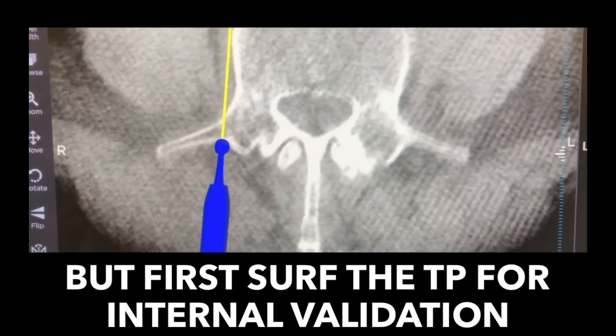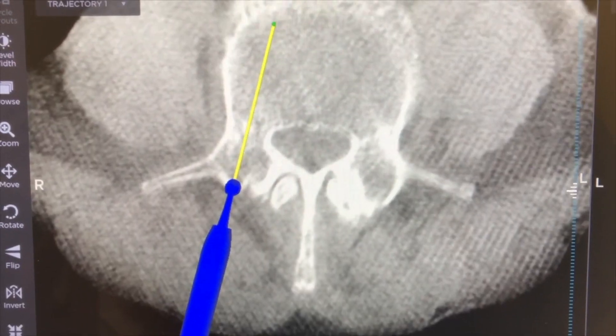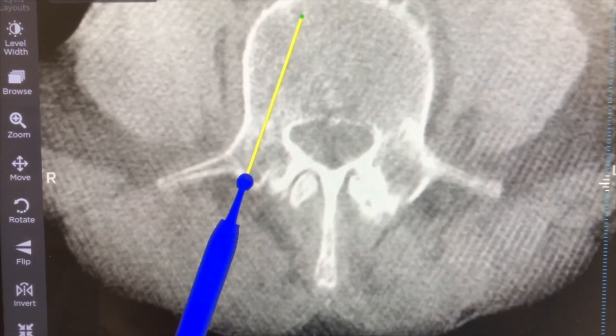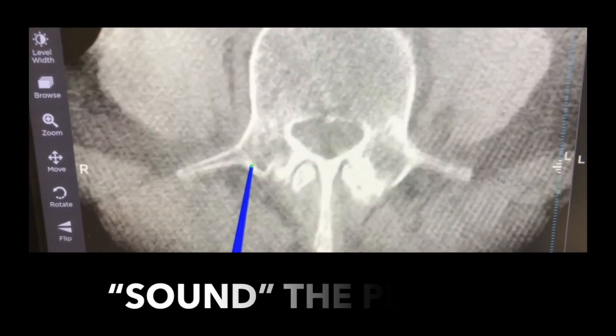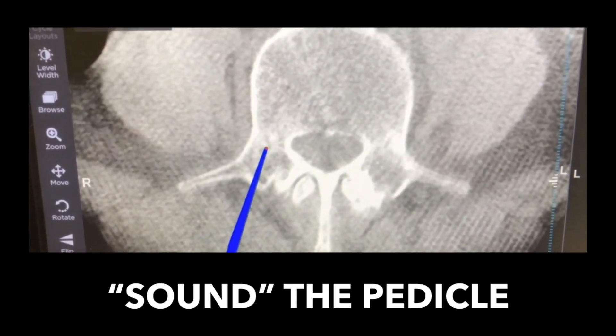Go lateral and then I should feel that little rise right there — that's how I make sure that everything's internally validated. Everything has to be consistent and line up. Extreme care required, soft touch. You just want to create a starting hole. So how hard is it to find that hole? About that hard.